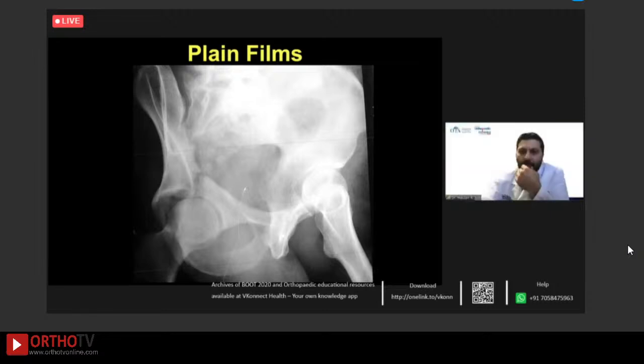So I think either supine or prone, I would certainly fix the SI joint first with a percutaneous screw. It would be easier to do supine because you wouldn't have the deforming force on the ilium, but even prone, you can probably get it with a percutaneous screw. The piece that worries me a little bit, and the fact that he has bilateral both bones, or even if it was unilateral, that you want to probably address, I'd like to do it supine, which means I would probably go from the front just to get everything done.